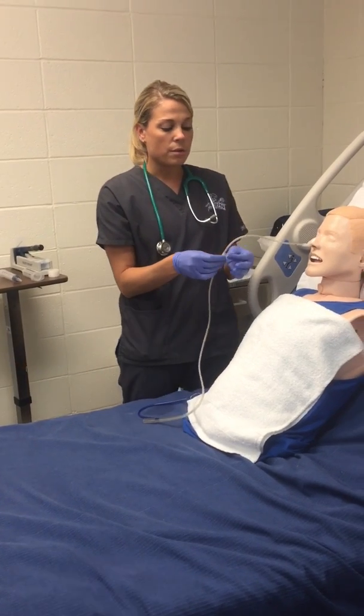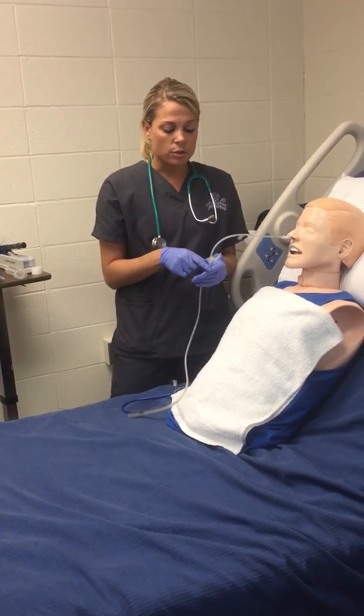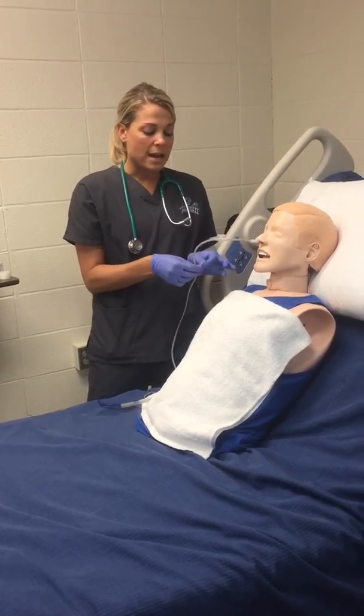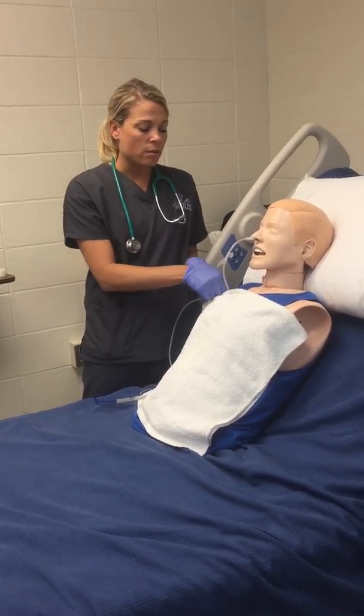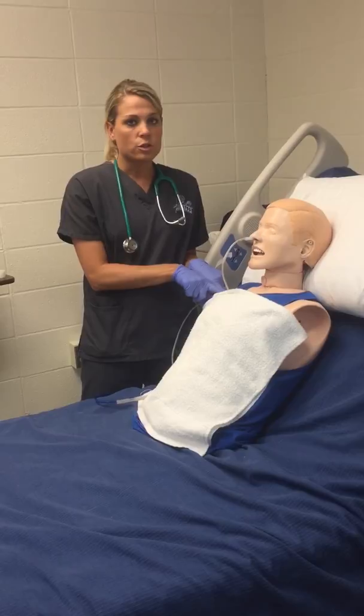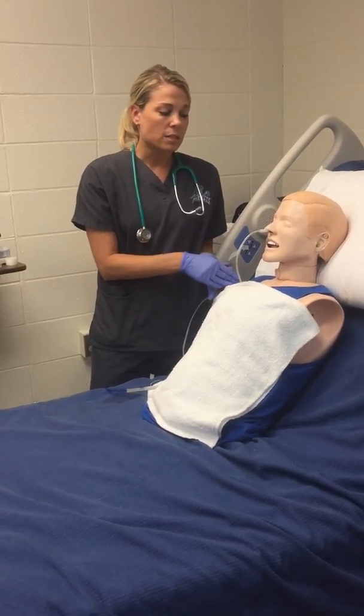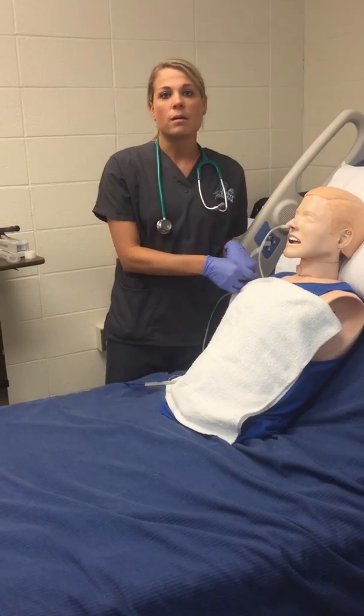We'll also put a tape lower down the tube, enough to where it provides enough slack for the patient, and then this way we can tag it, and then we can safety pin it to the gown. So that way the tube is also nice and securely placed, leaving enough slack so in case the patient does turn his head, it's not going to come out on accident.